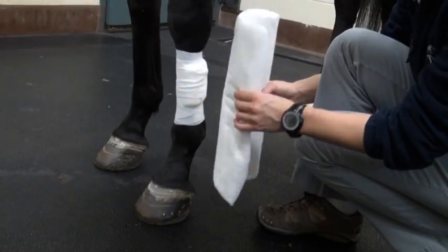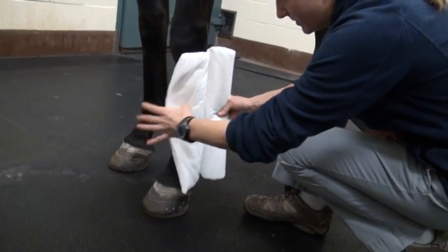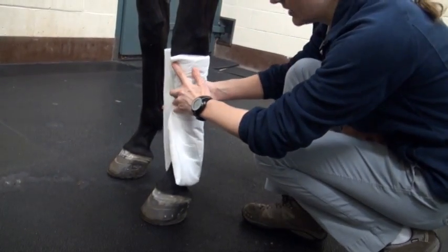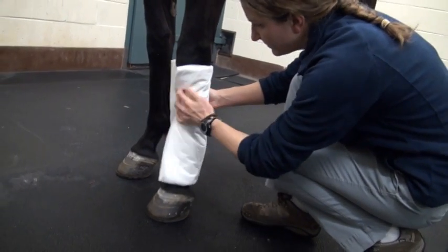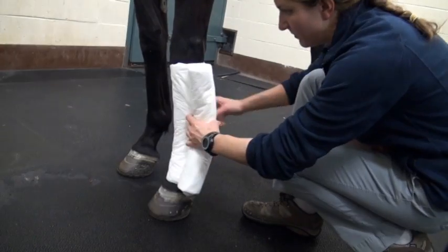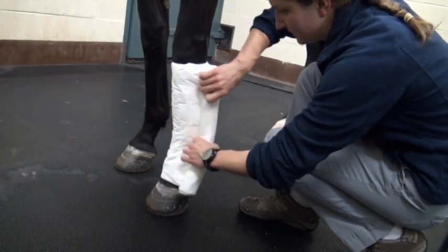The next layer of your bandage is going to be the sheet cotton. This should be placed with your wound centered under it, in the same area you would put a standing wrap. And this should be wrapped with nice even pressure and fairly snugly around the horse's limb.